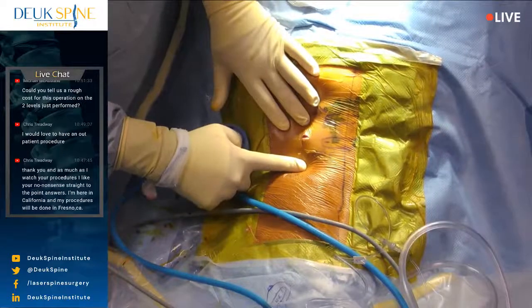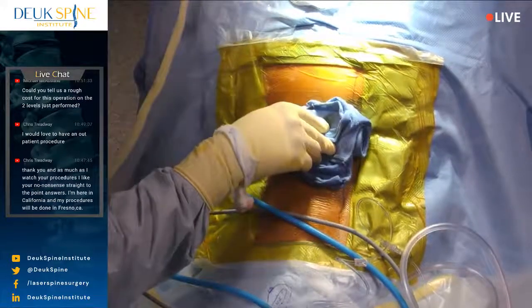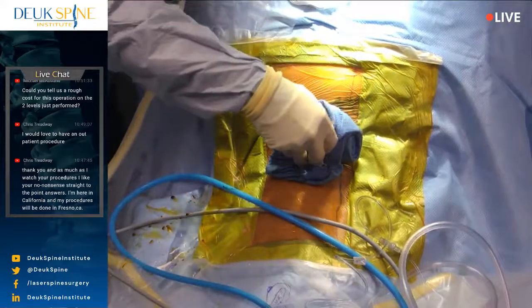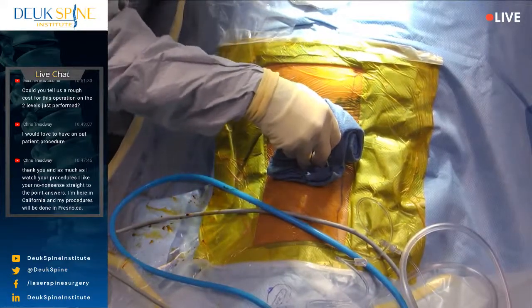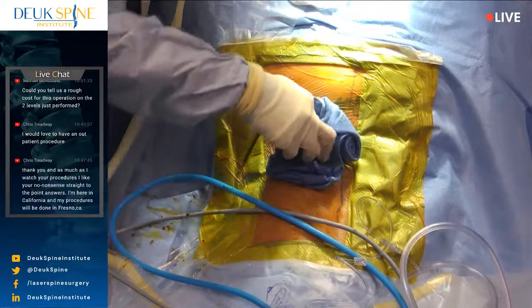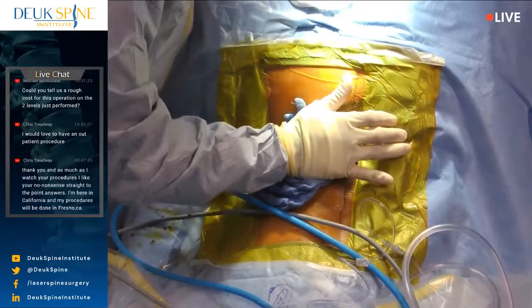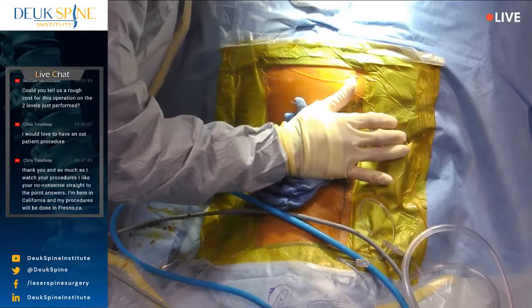There's your incision, 7 mm. We fixed two discs. Both discs were painful. We confirmed that. They were both causing her pain. One was a 10 out of 10 at L4-5. The other one was a 9 out of 10 at L5-S1.